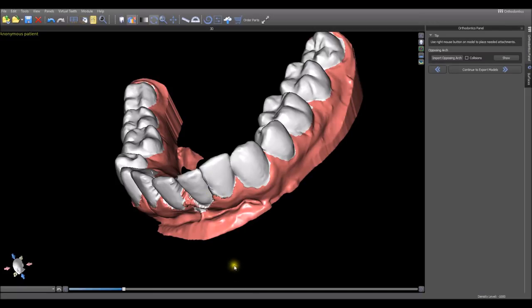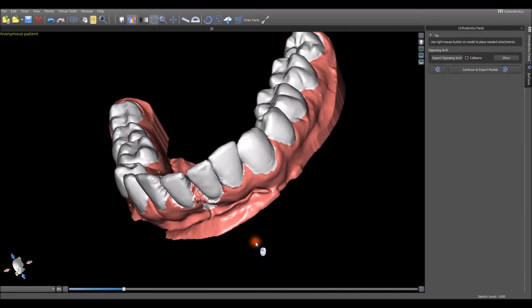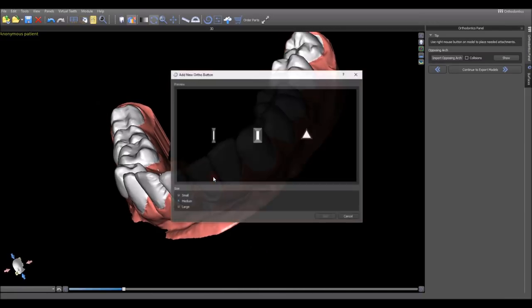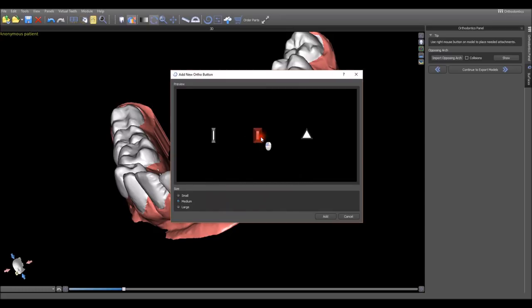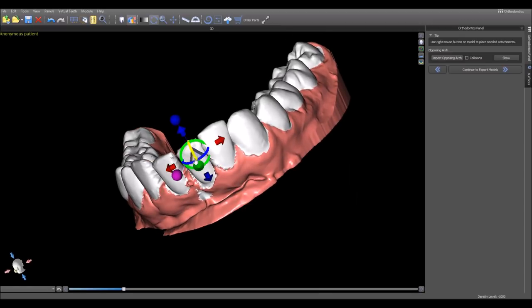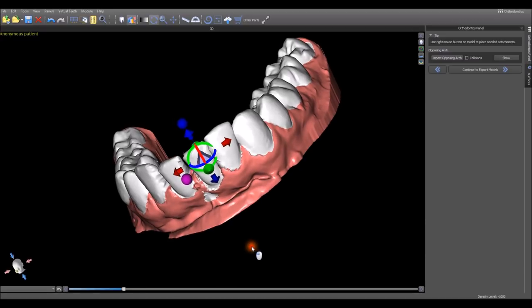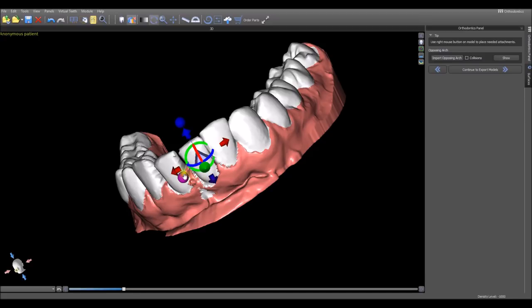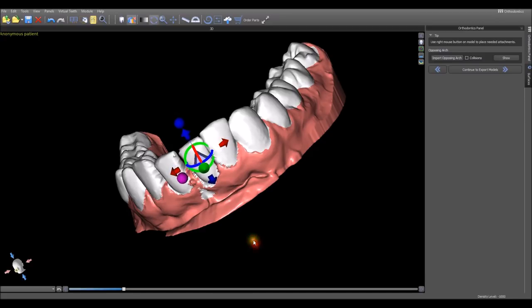Adding a button is as simple as right clicking on the relevant tooth and clicking add button. We can then choose the type of button attachment we want to add - small, medium, or large - and click add. It then appears on the tooth. If we move the mouse to the button, we have a widget showing up and we can fine tune the positioning of the button as we like.